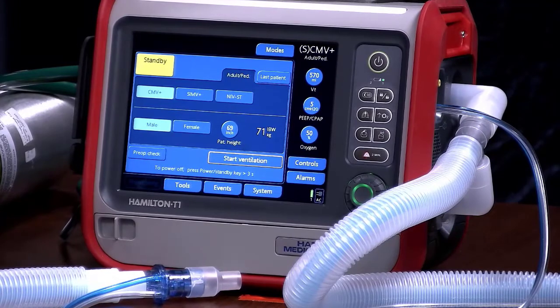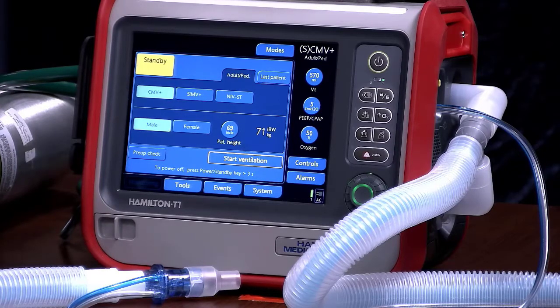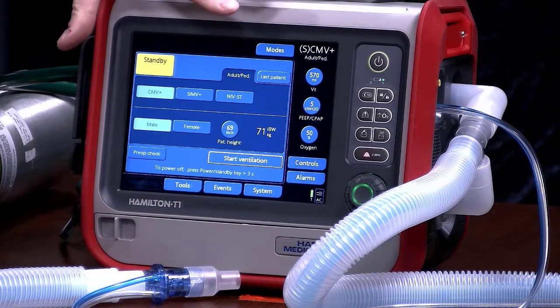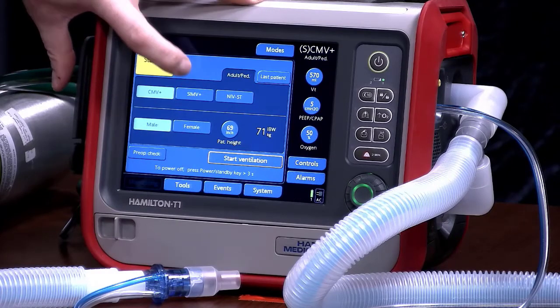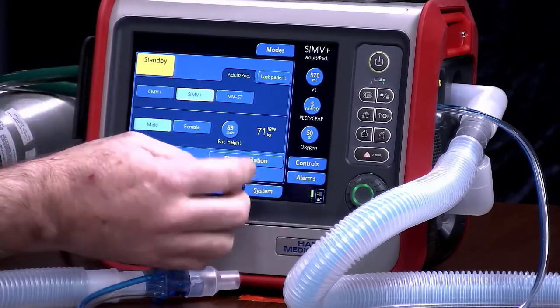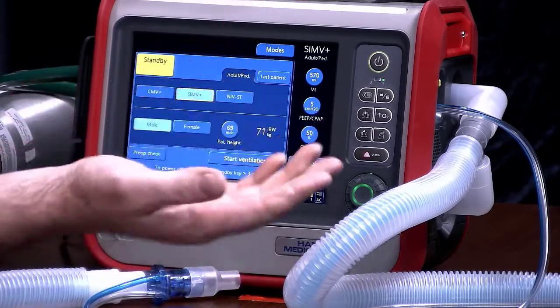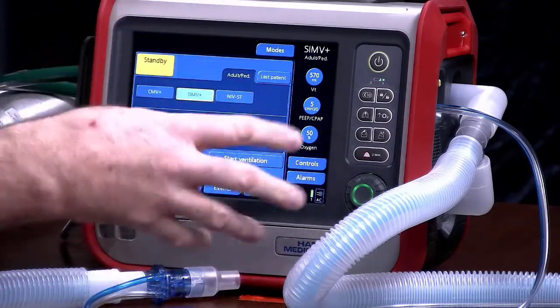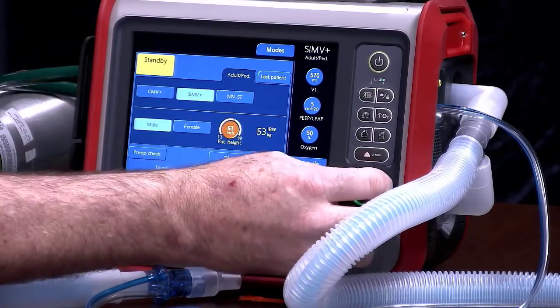When setting up the vent for use for our patients, I have to thank Scott Leonard, paramedic and respiratory therapist, who worked with us and talked to us about what to set this on. There are a lot of modes on this vent, some of which were not available on the Revell vent. For the most part, most intubated patients are going to be in SIMV+ mode. Click on SIMV+, and you'll be able to go and set the patient's height — this goes off ideal body weight, so we'll set the patient's height, for example, 69 inches. Any setting you change on this monitor requires you to touch that number and then use the knob to select and change the number.